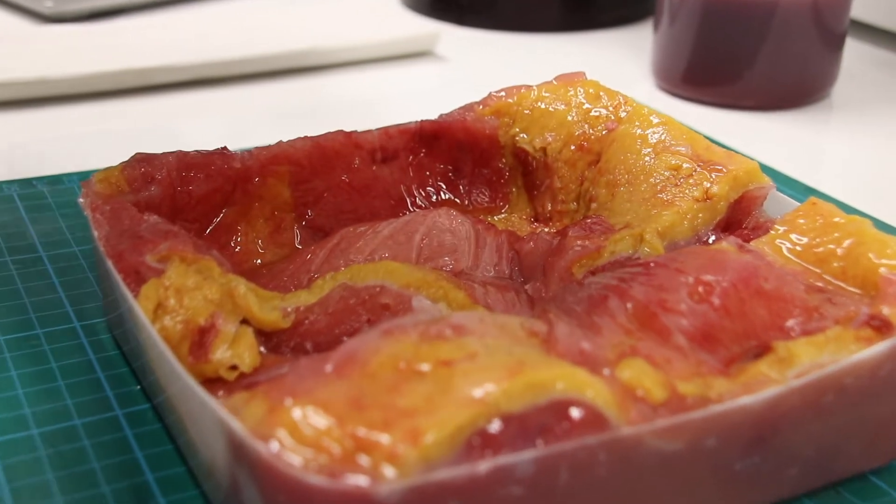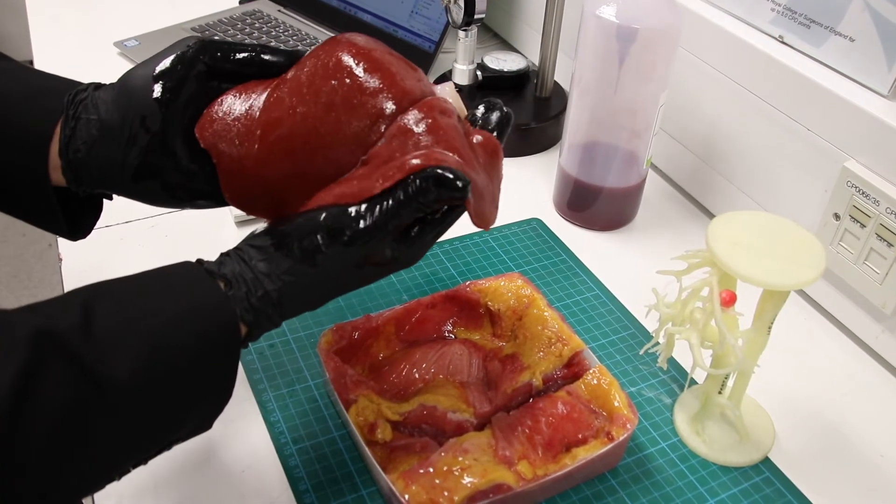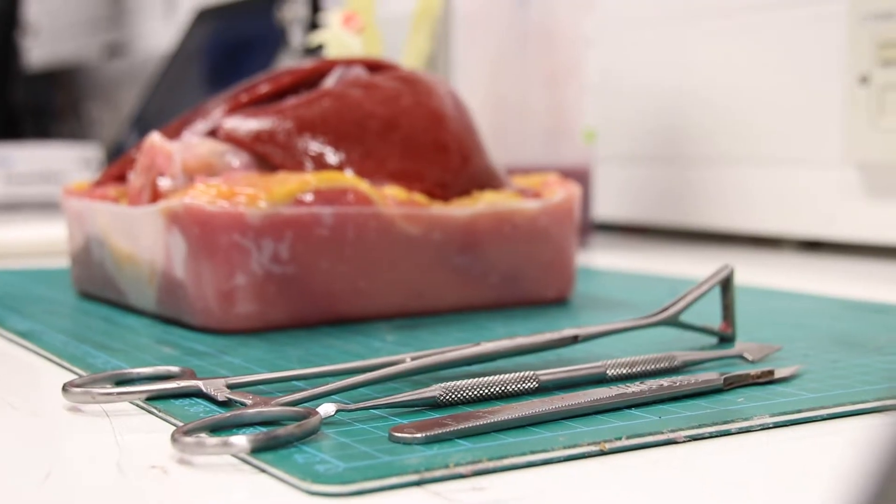This is a silicon gel that we have used to create this surrogate tissue. Looking at different works which had been done before and different studies, we mastered that technique and we create this liver tissue. This is a real operation for the surgeon.